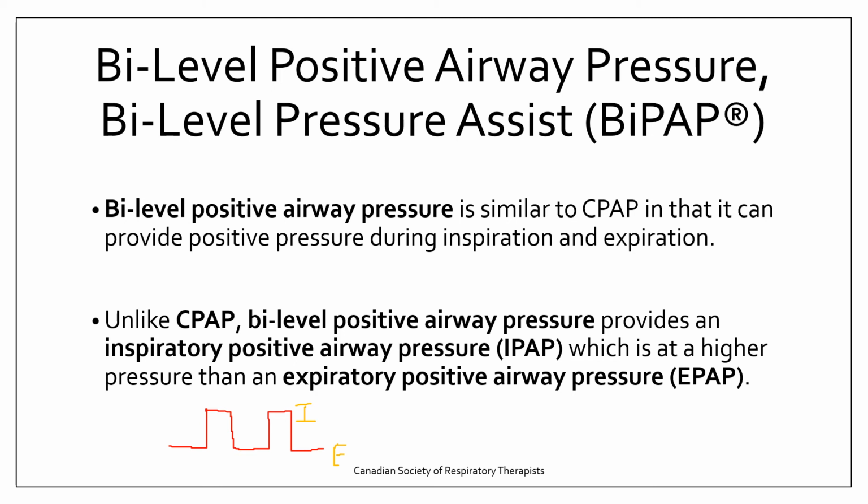So I just caution you to understand, to look at the ventilator that you have at your facility and what ventilator you would be using with this mode and how this mode works, and understand if you're setting a support level and a PEEP, or if you're going to set a PEEP and a peak inspiratory pressure, and what happens if one changes. If your PEEP changes, does your support change, or does your peak inspiratory pressure change, and how they change.